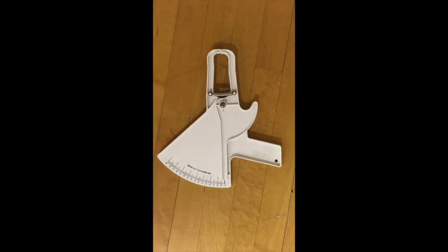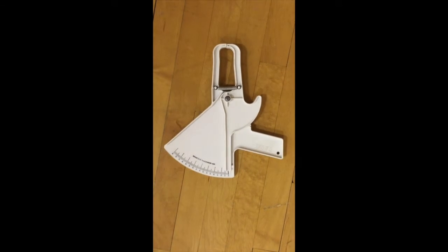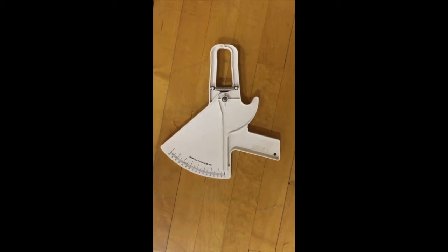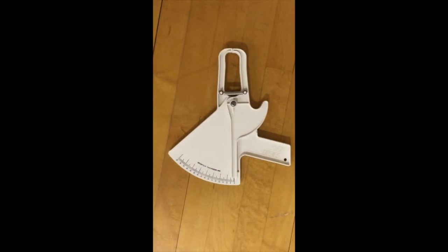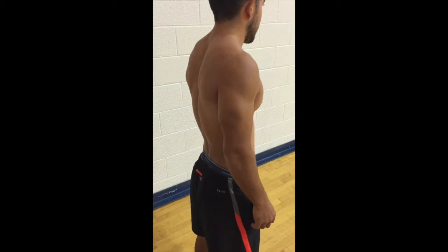Make sure to take duplicate measurements at each site and retest if duplicate measurements are not within 1 to 2 millimeters of each other. Rotate throughout measurement sites or allow time for skin to regain normal texture and thickness. Each measurement site should be marked before being measured.